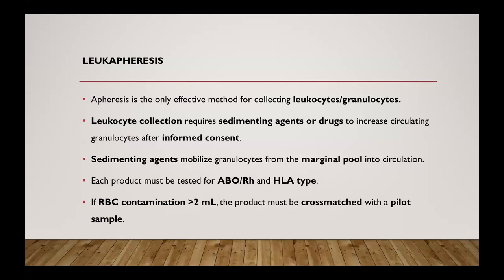If contamination is suspected, similar to platelets, we have to attach a pilot tube. The pilot tube is just a tube you collect in an EDTA tube. It should be attached and should accompany the leukapheresis unit in order to be cross-matched with the patient blood.